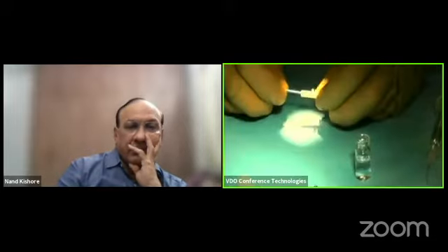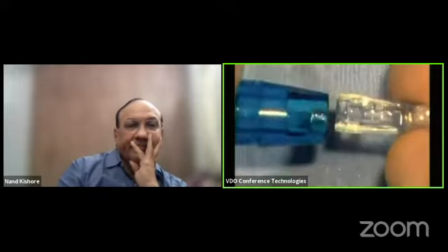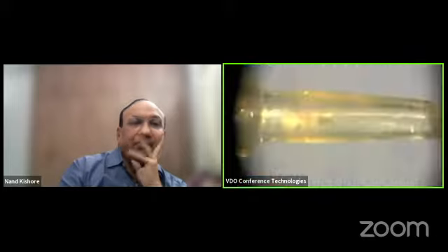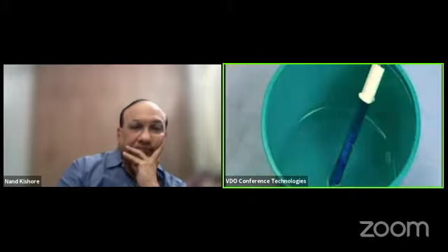and then again the plunger has to be placed into the injector, and the cartridge is fixed to the injector, and we should not take much time. It should be implanted within 1 minute. After the ICL placement, we need to check the ICL position.